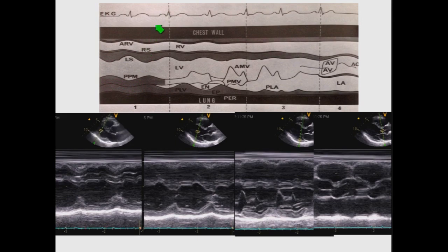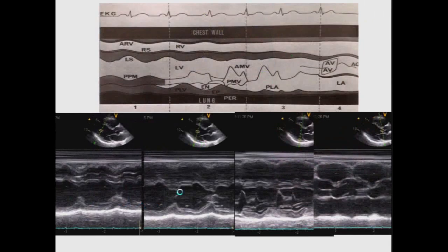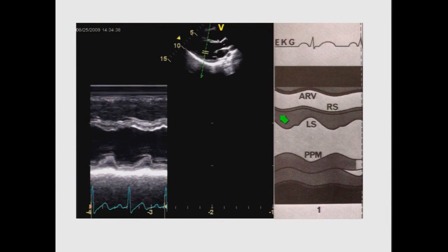Here we've got the M-mode cursor going through the main body of the left ventricle. Let me just move back up. Here the M-mode cursor has moved up a bit, and we're starting to catch chordal structures of the left ventricle. With this position here, we've got the M-mode through the mitral valve, and Dr. Kronzen elegantly described to you the various motions of the mitral valve. We'll reiterate that in a second. And finally, as we swing the M-mode cursor up through the base, we go through the aortic valve. So I'm just going to go through each one of these things.